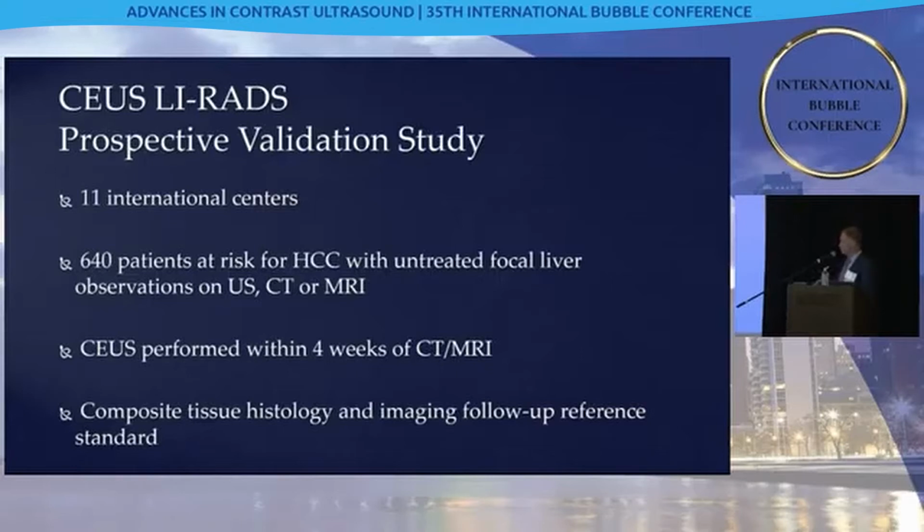We have a very strict and very rigid protocol, and thank God we have fantastic researchers working with us and very good research coordinators. So we were able to achieve all this rigorous patient selection, and we were able to get contrast-enhanced ultrasound and CT and MR performed on every single patient within 4 weeks of each other. So there is no delay in diagnosis, and there is no risk of running into changes in appearance of the lesions as time goes on.